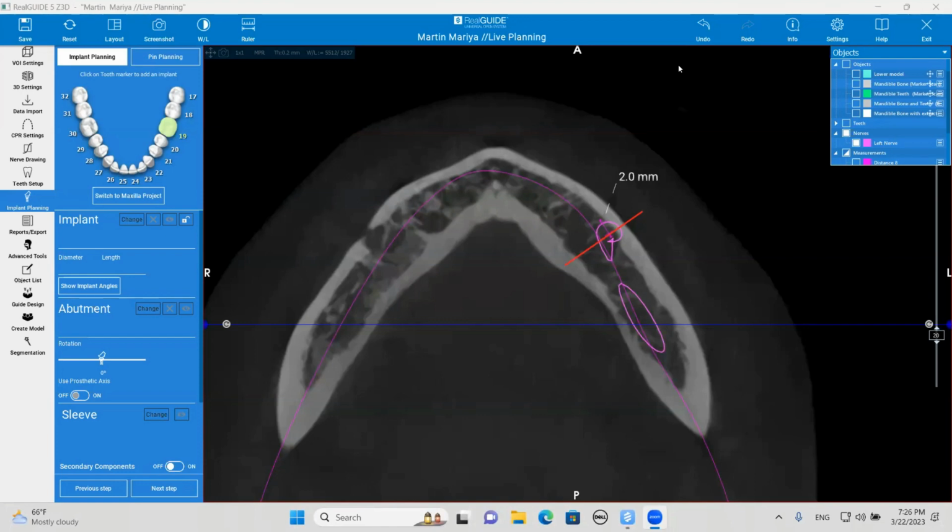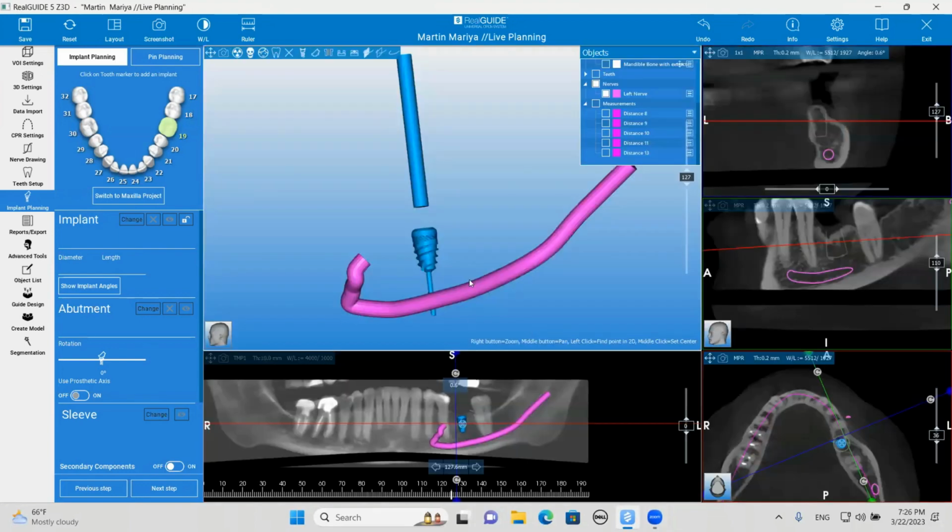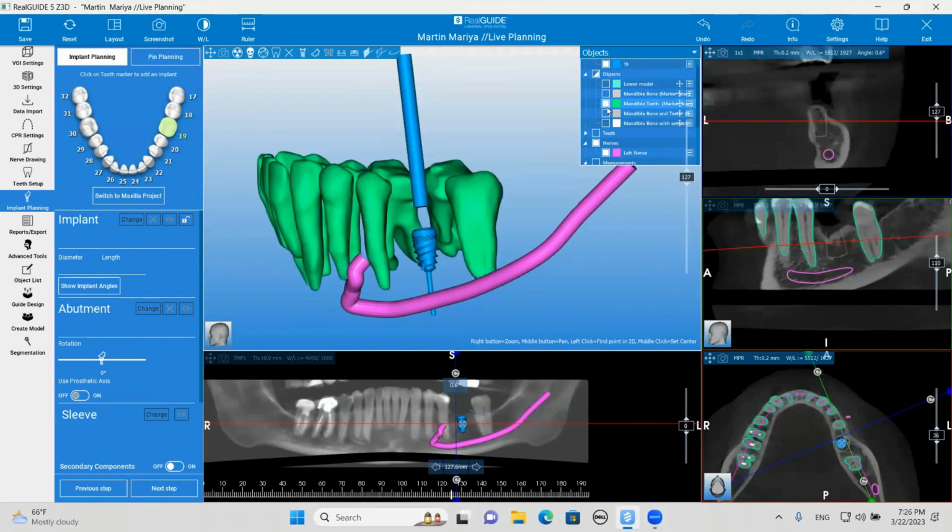Yes, yes. Okay, good. So let me see what else. Anything else that we can show you on this, Scott? That was excellent. The only other comment I would make is, what do you think about undersizing the osteotomy? How do you think the quality? Very good. Actually, I meant to even say that.